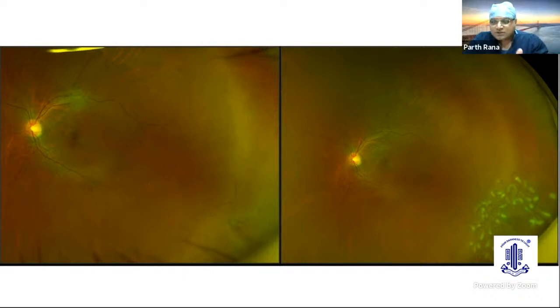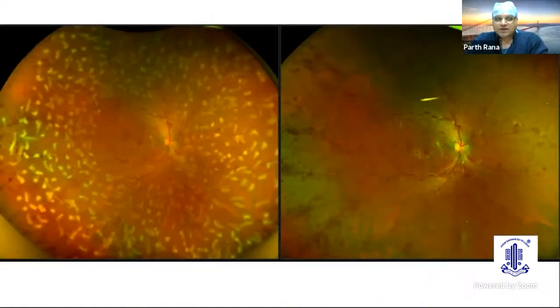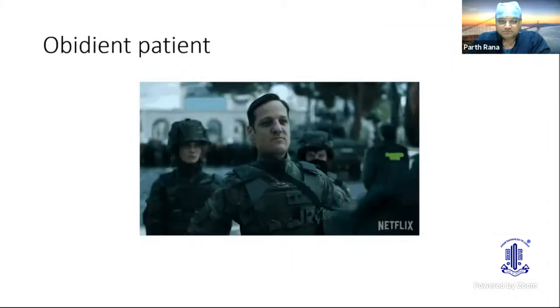And when we lasered, we showed the evidence also that I have already lasered your retina. So we always need evidence. Here we can show the patient that the patient is having a retinal hole. One patient had CRVO, and we did FFA, and then we asked the patient to undergo the laser. Once the laser was done, the patient asked us how the laser was done and what all areas you have lasered. We can show it here, how the laser was done.